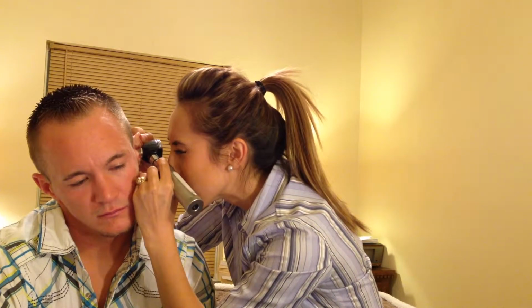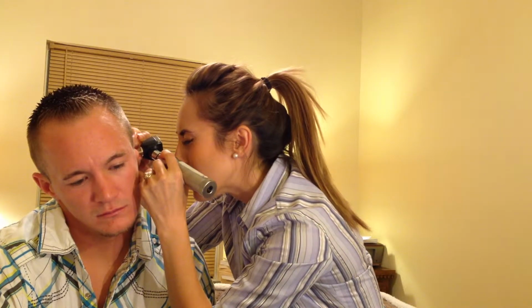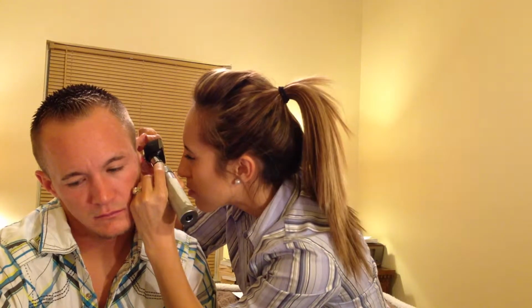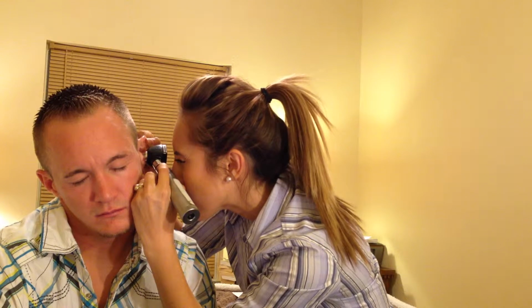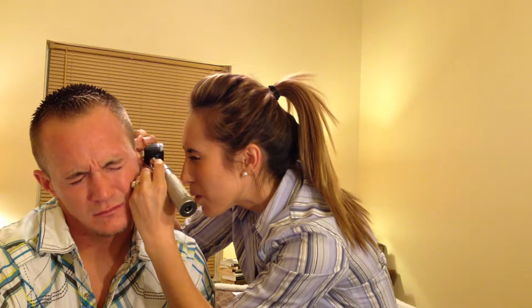So what I can see here is pretty clear. I can see the tympanic membrane, and I'm looking at the auditory canal around. I see tiny little vessels everywhere. I don't see any cerumen anywhere, pretty clean. And then I'm looking here to take a look at the tympanic membrane, and I see that it is grayish, pearly gray in color. It is transparent, and right in the middle of it I can see the umbo, and I can also see the landmarks. The umbo, I could see the handle of the malleus going upward, and the annulus.